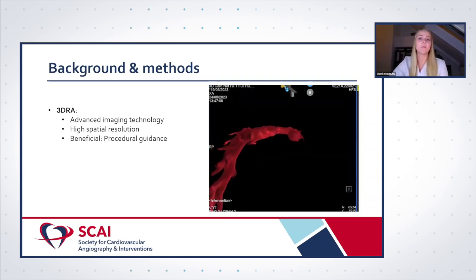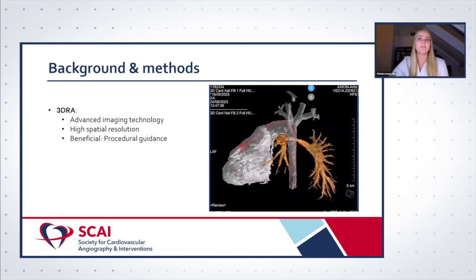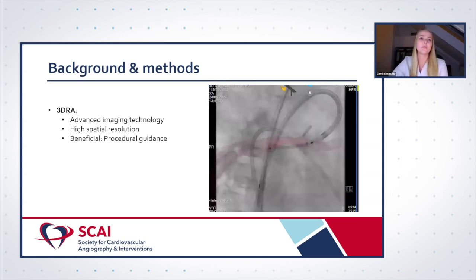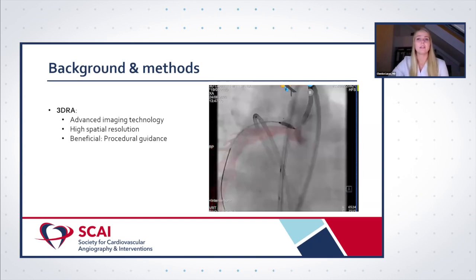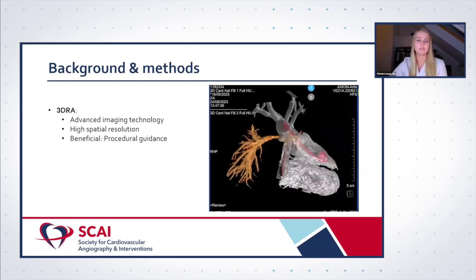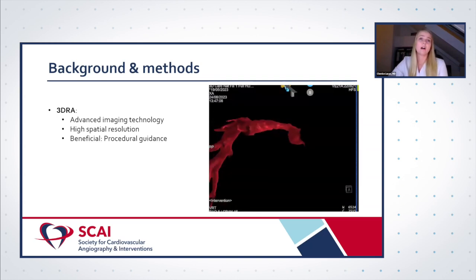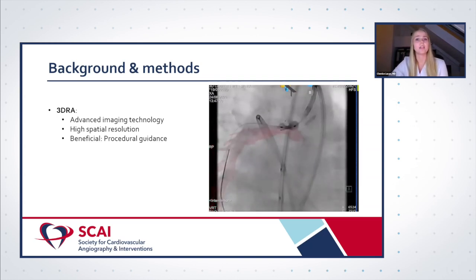Despite evidence of superior imaging quality in 3D-RA, it is still used with restraint in neonates and small infants, considering they're often in critical conditions. If catheter interventions are indicated in this group of small patients, then biplane angiography is the standard to visualize and treat relevant lesions. However, although being complex, we believe that 3D-RA can be extremely helpful to understand and guide interventions in this group of small and vulnerable patients.